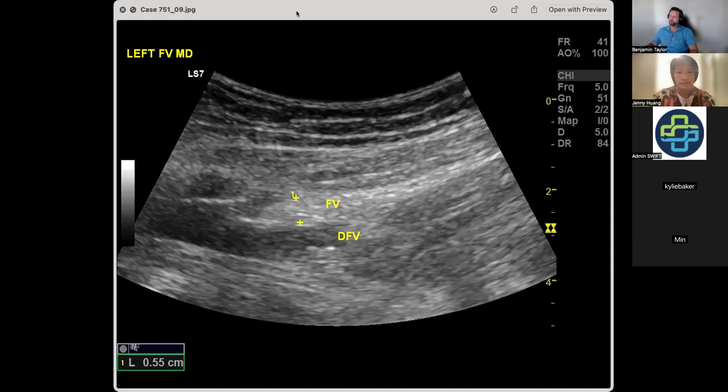Ben, quickly jump in. Which way round is it? What's the difference between old clot appearance and new clot appearance?